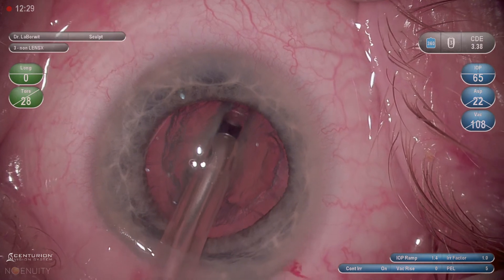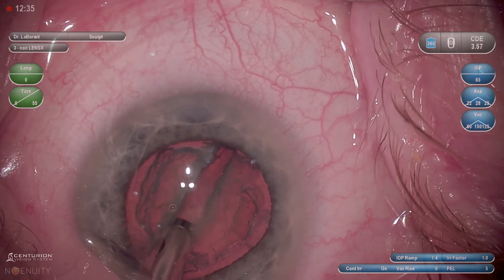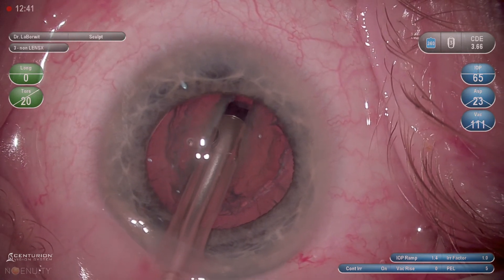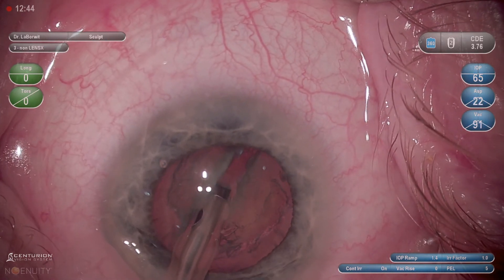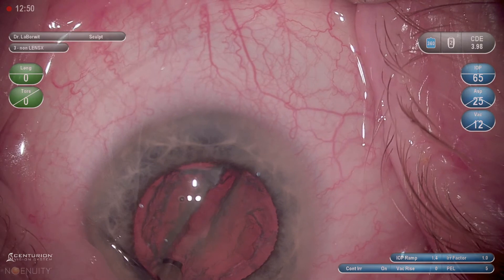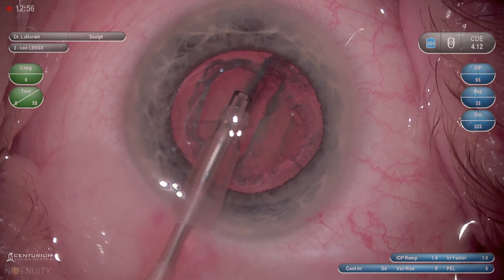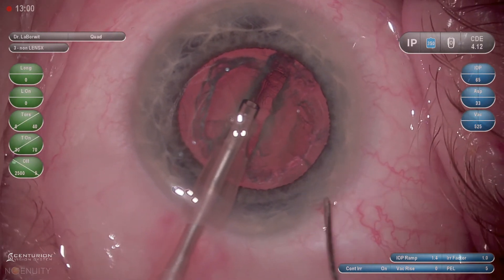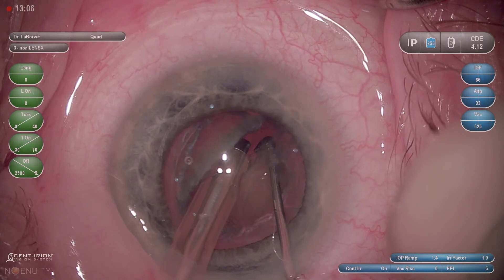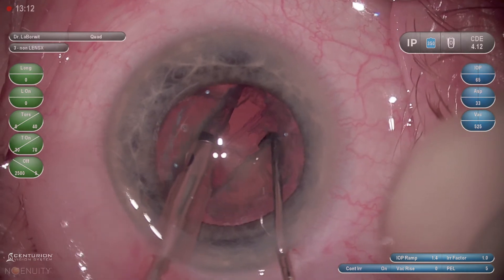I'm always mindful of the distal third, knowing the posterior capsule curves up, and you'll see I'm very gently trying to remove about the top 50% of this lens. At this point I've debulked proximally—I'm using the tip to get a little deeper in the middle third but keeping the tip as flat as possible during this section of the groove. I'm even sculpting a little more proximally to get a better approach to the middle. Now placing the second instrument, I'll go to the distal third deep into the groove, creating a crack and unzipping it from there.